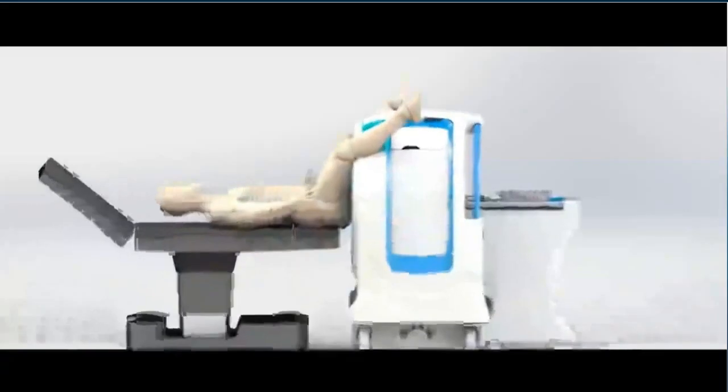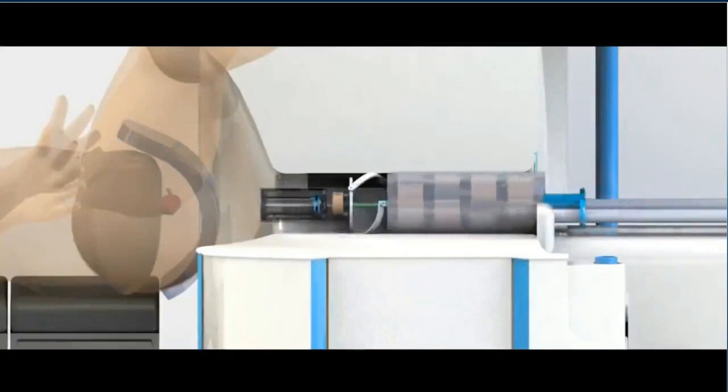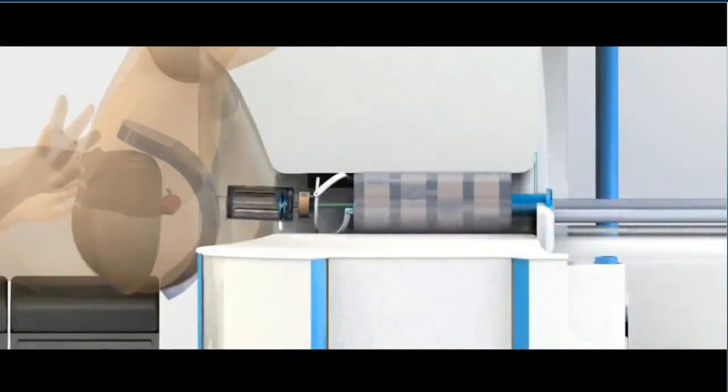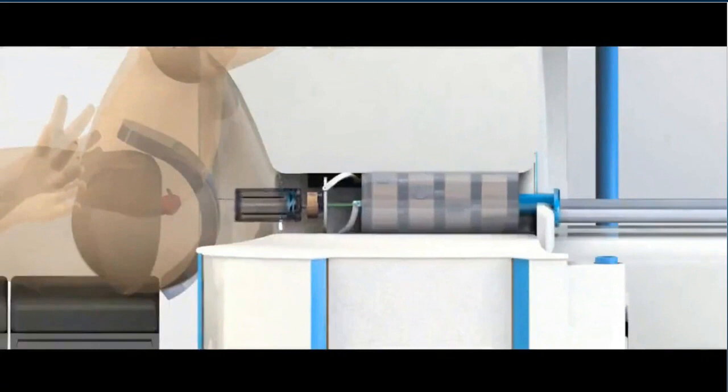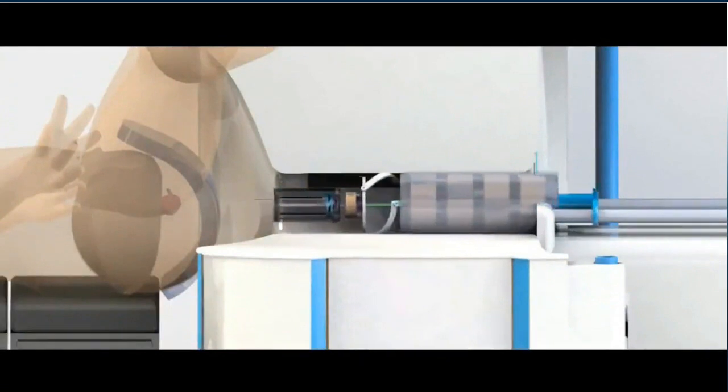Here you'll see a video of our current robot that fits within the system. It's a standalone device that is accessed from the back of the MRI. It travels through the access aperture that's between it, and it moves around in 5 degrees of freedom a biopsy end effector that allows us to take different biopsies from different sections of the prostate. This end effector can be switched out for various different types of treatment techniques, for example, brachytherapy or laser ablation or cryotherapy.